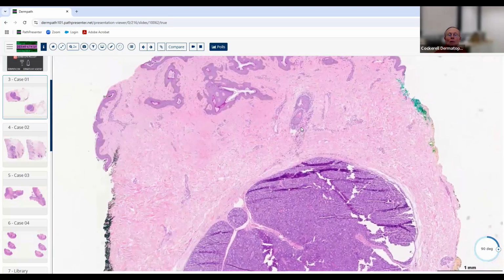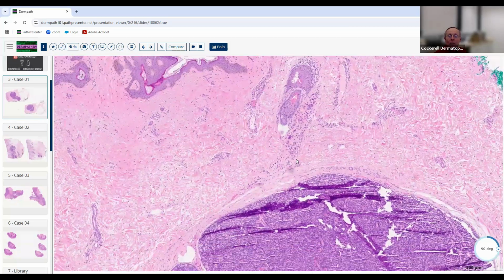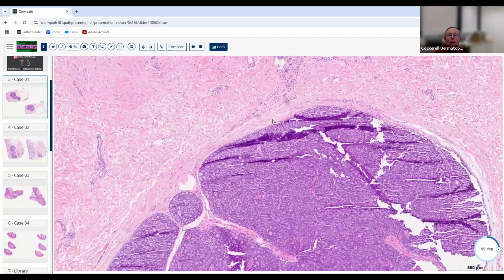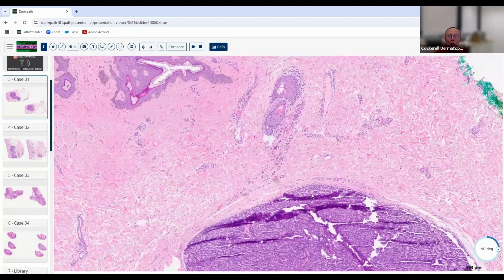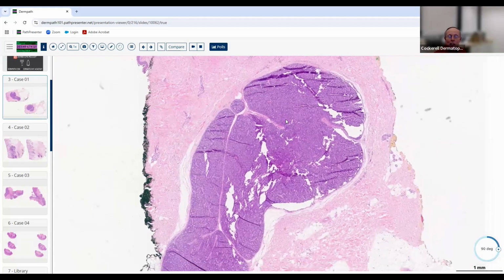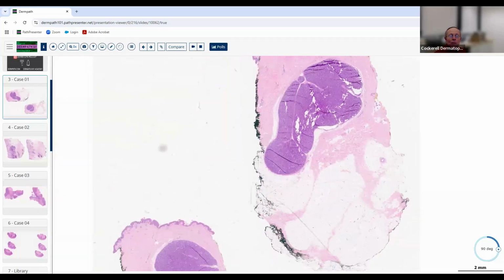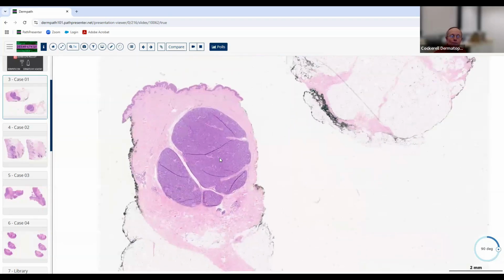Here we go. There's a follicle up here. So it's possible it could be toward the matrical epithelium of a follicle, at least in part, because that can give you these basophilic structures. This side over here has a little more tearing in it, so I didn't focus on that. But see, it's got a vertically oriented teardrop sort of shape to it. That's also a sign of benign, if something is vertically oriented, just an interesting clue at low magnification.